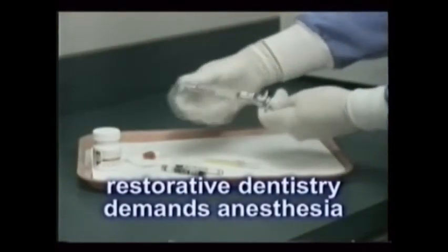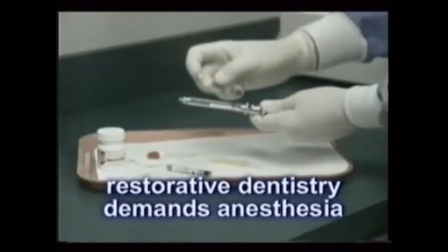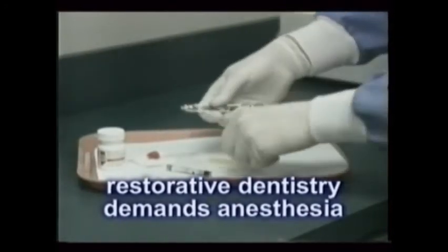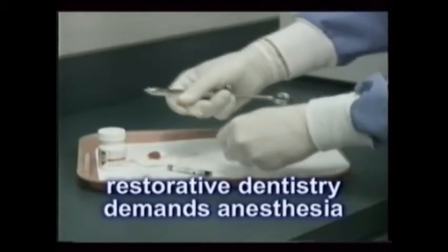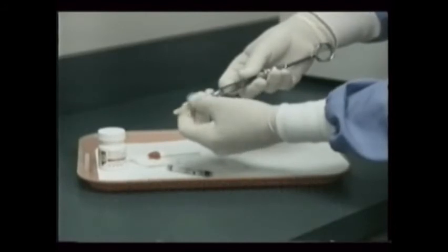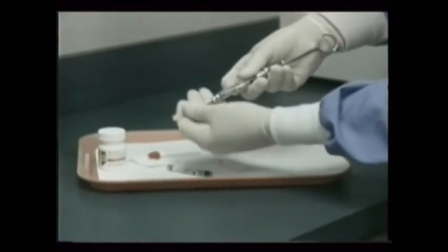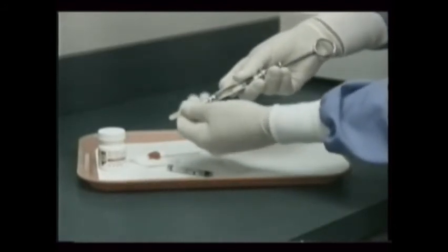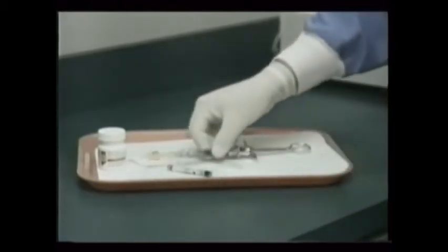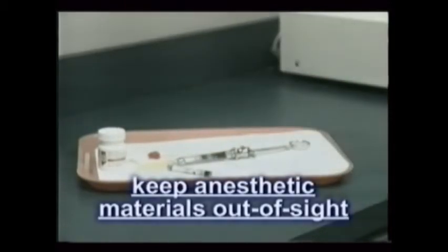Rarely is restorative dentistry provided without a local anesthetic. Occasionally a patient might request it and even tolerate treatments without being numb, especially if the decay is small, but it's pretty rare for them to do this. Have a topical anesthetic ready preceding the injection. This offers an extra touch that helps enhance the anesthesia and also the patient's trust. And remember, always keep that anesthetic syringe and the needle out of the patient's sight when you're using it.